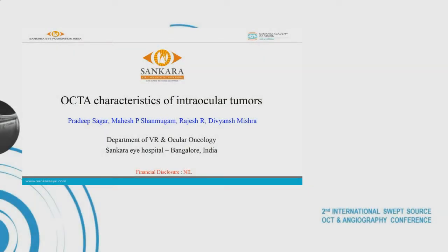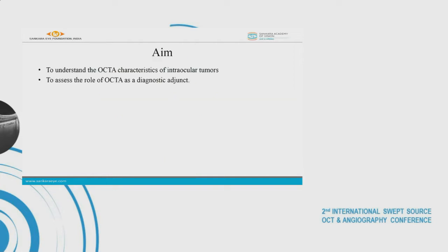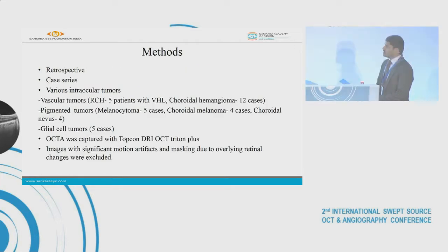First of all, I would like to thank the organizers for giving me an opportunity to present a work on OCTA characteristics of intraocular tumors. Our aim was to understand the OCTA characteristics of the intraocular tumors and also to assess the role of OCTA as a diagnostic adjunct in diagnosis of these tumors.